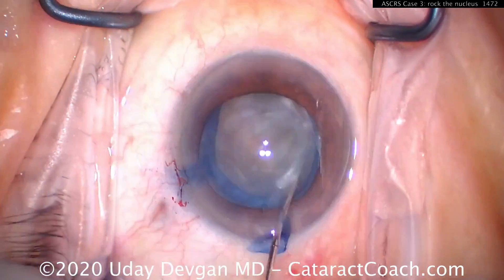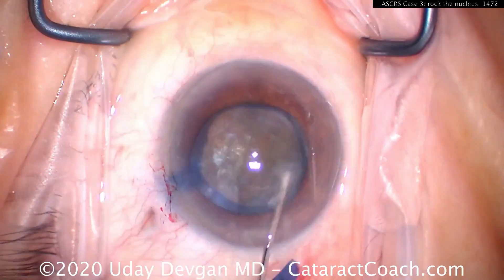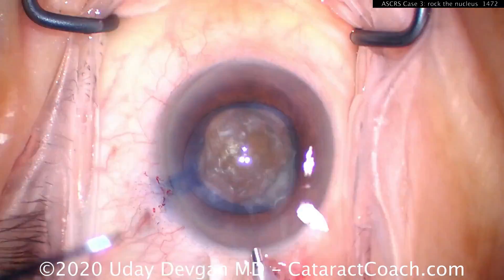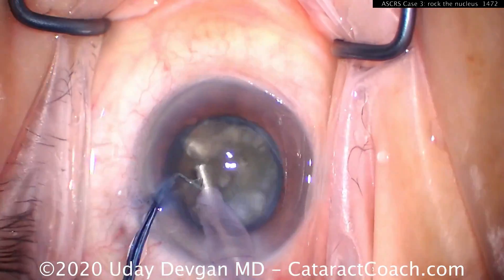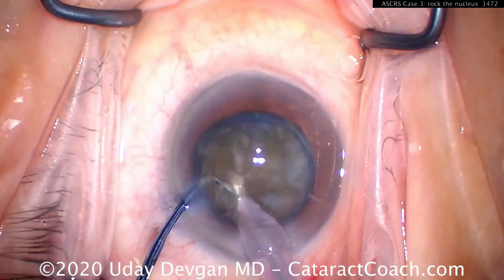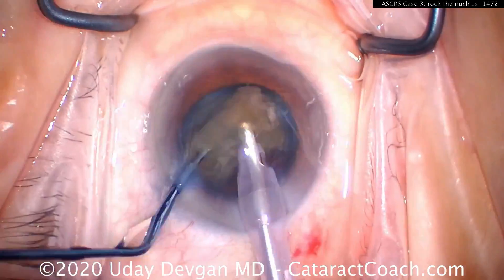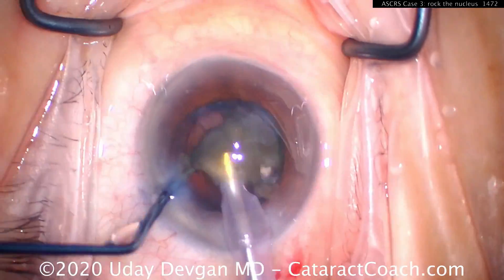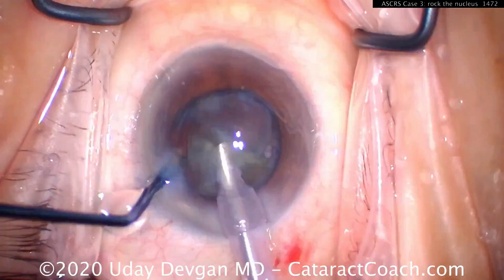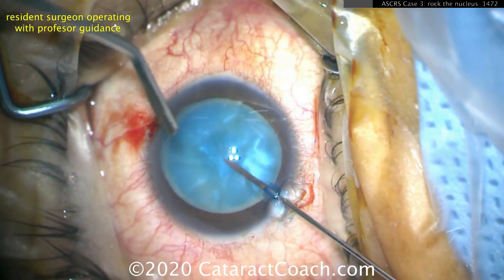You need to be able to decompress that capsular bag. Otherwise, you're going to have a tough time. Look at all that liquefied lens material that came out. At this point, we can just phaco this dense cataract and be done with it. The key for an intumescent cataract is depressurizing the capsular bag by releasing the intumescent liquefied lens cortex material, which is not only in front of the nucleus.